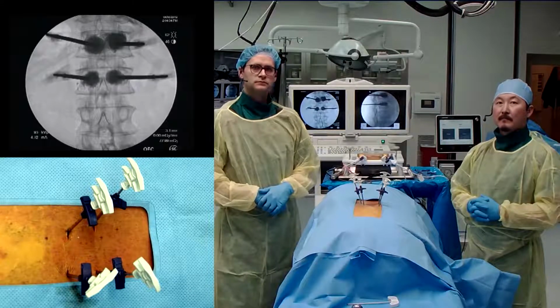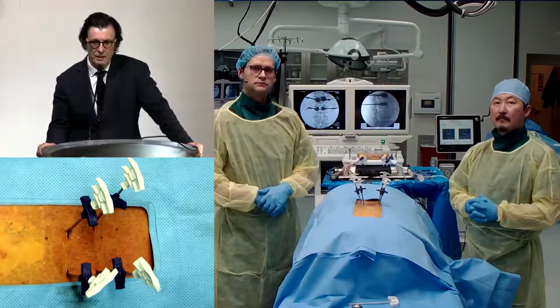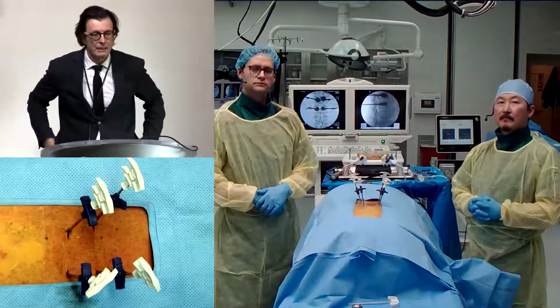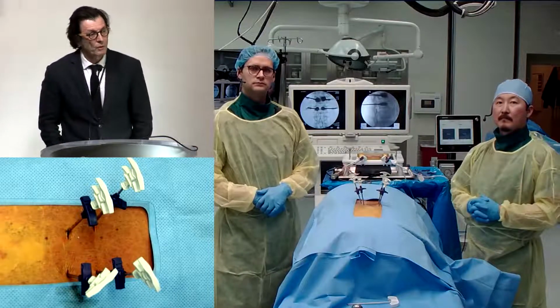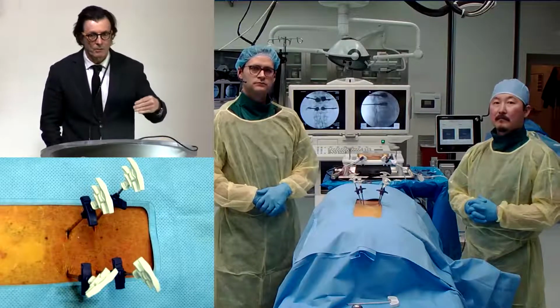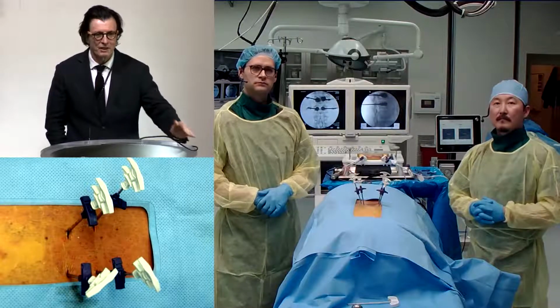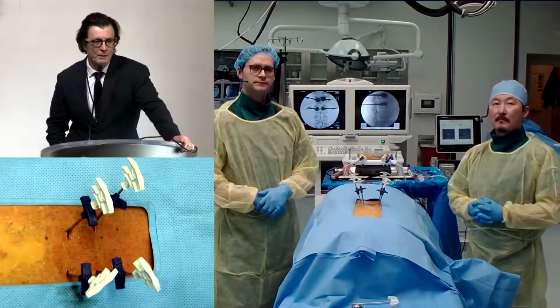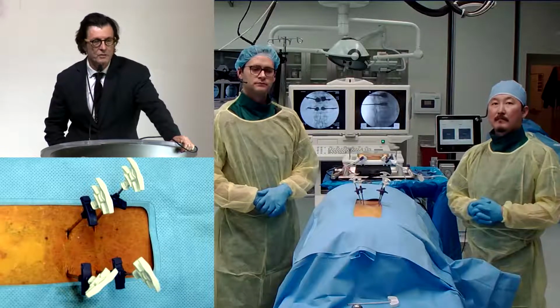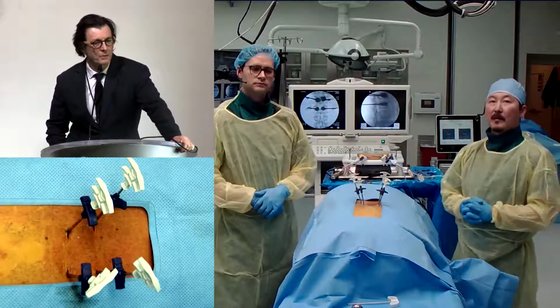Most of the time, even if there is a little bit of cement in the canal, the patients have no symptoms related to it. How many times do you see patients who have a little bit of cement in the canal, no symptoms? But what do you do when you have a patient that wakes up with a deficit? It gets me to the point that when you do these procedures, make sure you examine the patient after the procedure, especially when you're worried about cement migration into the canal. You have to examine the patient and make sure there are no issues. What do you do when you have cement migration into the canal and the patient wakes up with a deficit?